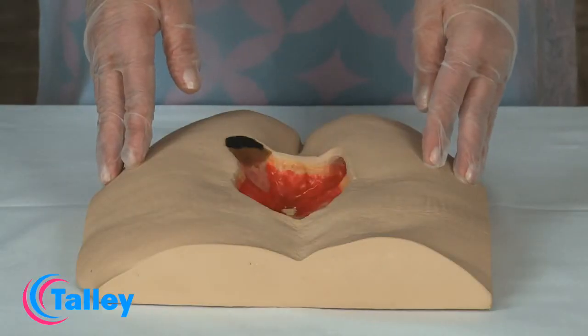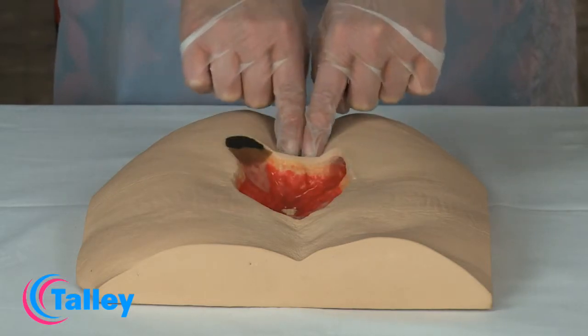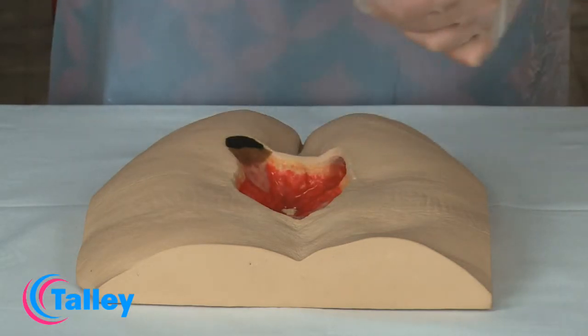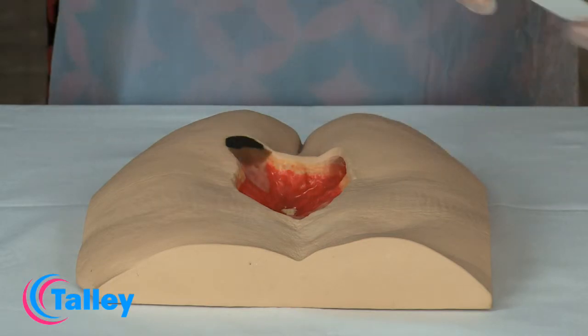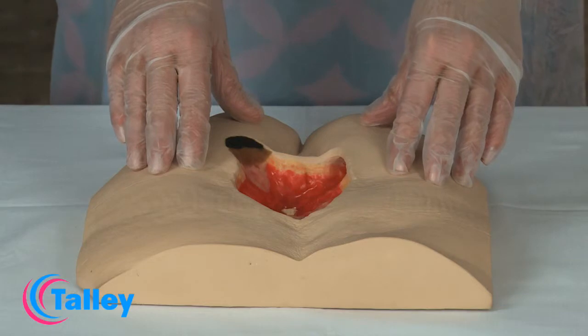There are a number of factors which need to be considered prior to application: the peri wound skin, the depth of the wound, the underlying structures, and finally the application of the treatment.